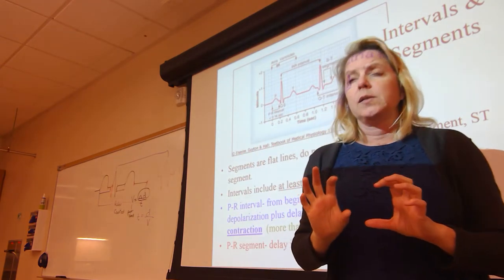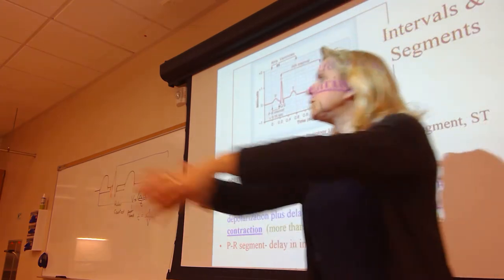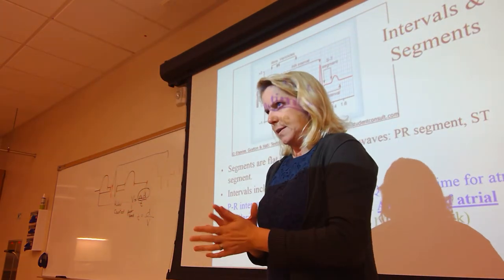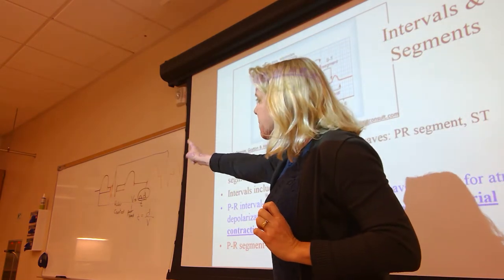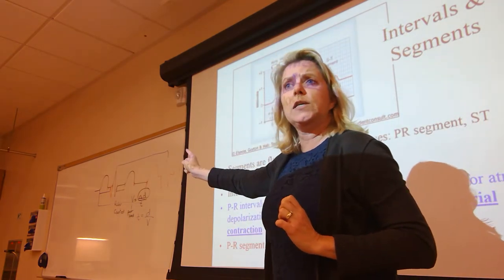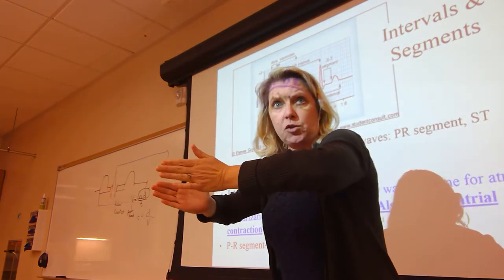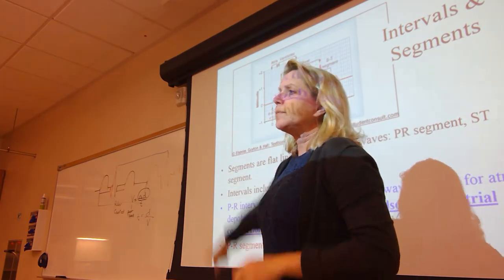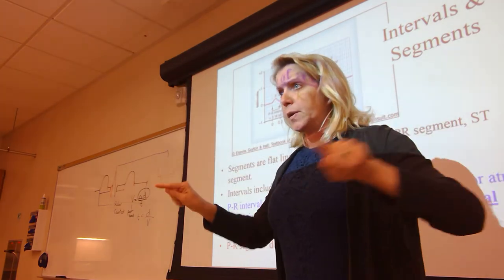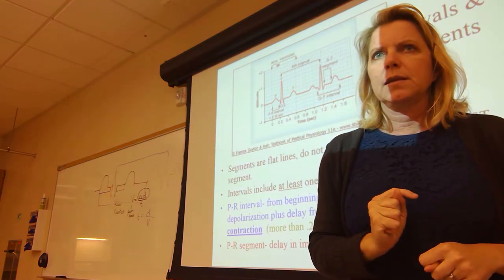Next 2 points. You will calculate an interval or a segment. Which one depends on which test version you get. 1.5 for correctly marking on your EKG lead where you began your measurement and where you finished, showing me that equation. 0.5 for boxing your answer with the correct units, which is seconds.